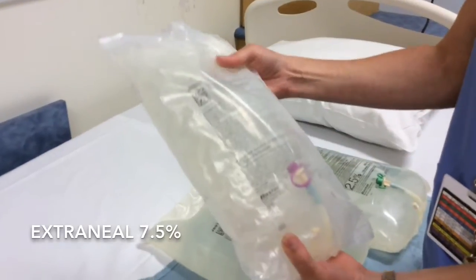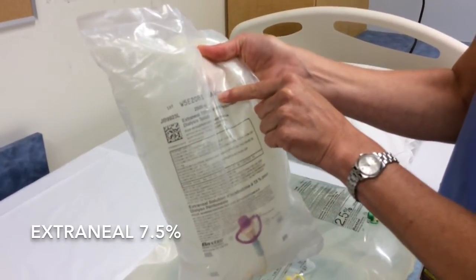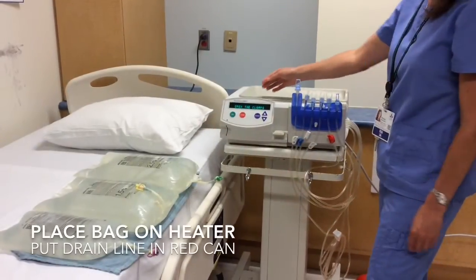The extraneal bag is different. The expiry date is on top, not on the bottom. The strength is written right underneath: extraneal 7.5%. Once the self-testing is complete, the display will say 'connect bags, open the clamps.'